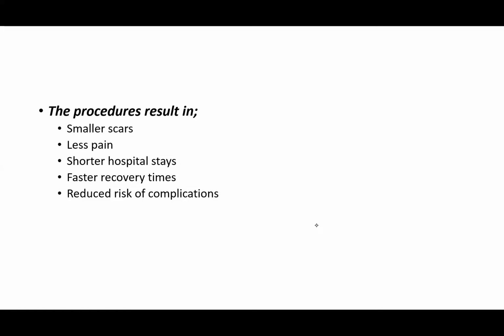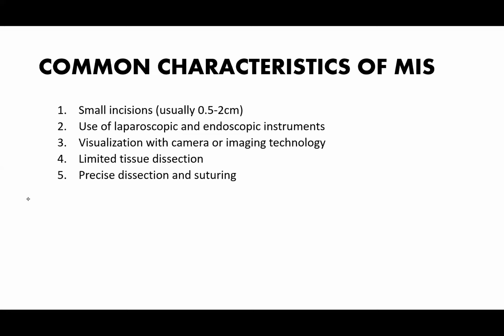Minimal bleeding might appear as torrential because of the magnification. So that magnification gives you a clearer picture on anatomical dissection and identification of structures. And in turn, this will reduce the risk of complications in patients.